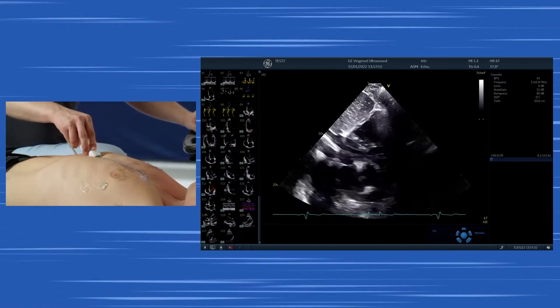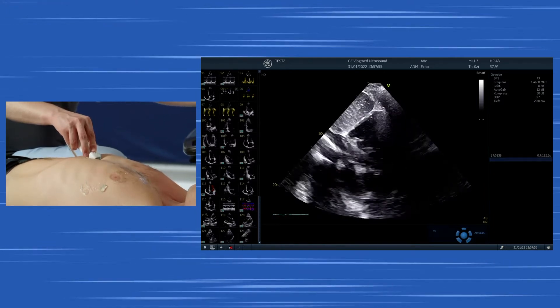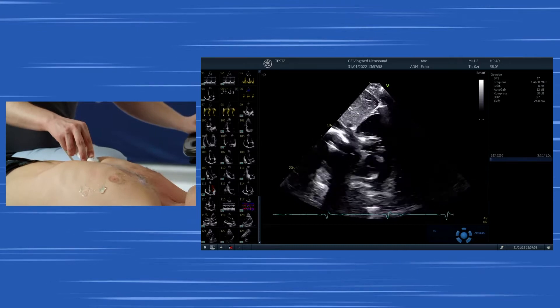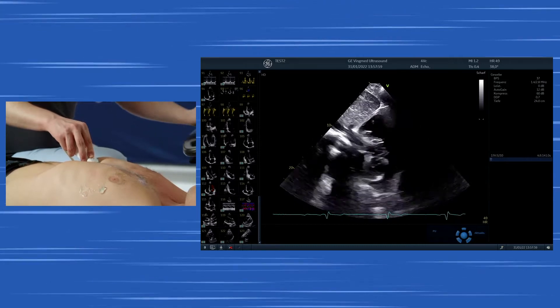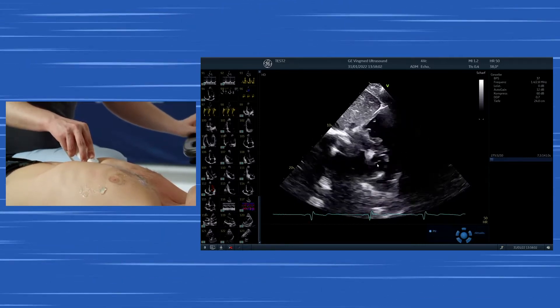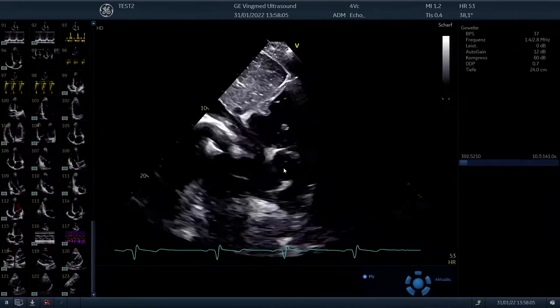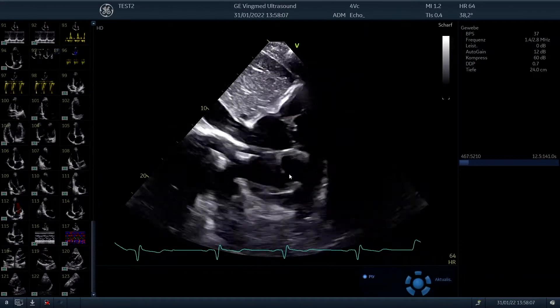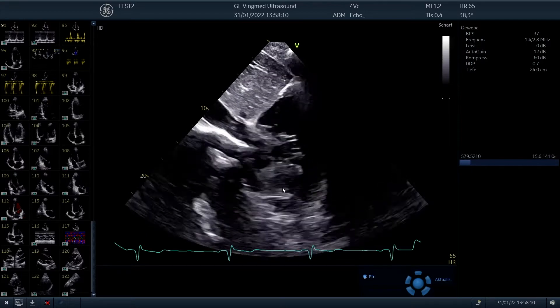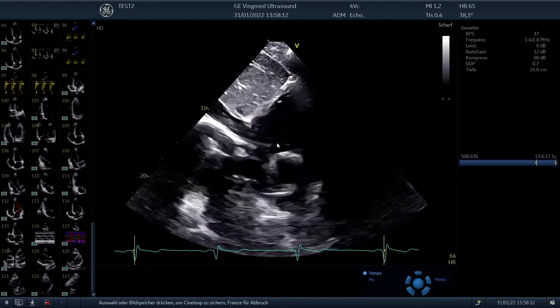The first view is just a normal plane towards the heart. As we rotate the transducer, the marker points to the left side of the patient, away from us. If we rotate the transducer to a short axis view — as we would know it from the parasternal view — we can acquire the aortic valve in short axis from a subcostal approach.